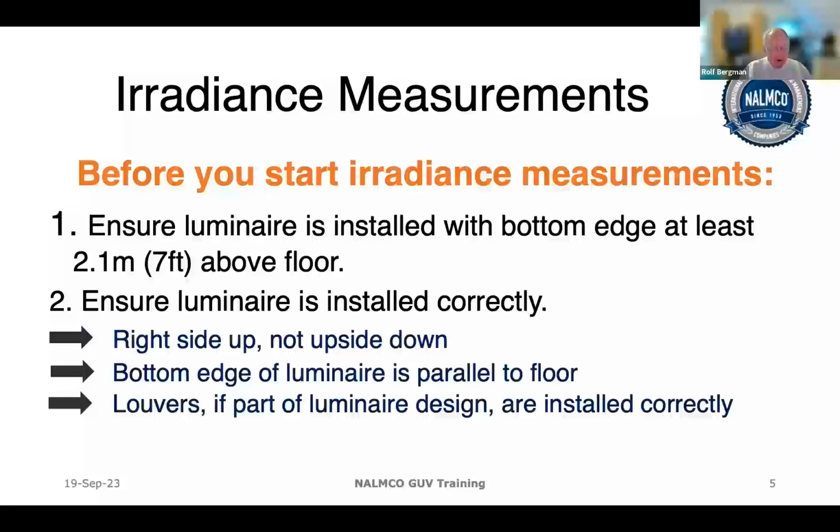Also, most upper room luminaires have louvers to direct the light in a beam pattern. If they have louvers, then the louvers sometimes can be rotated a bit, so you want to make sure that they are installed correctly. So now, given that we have a correctly installed luminaire on a wall, we're going to make some measurements on that.